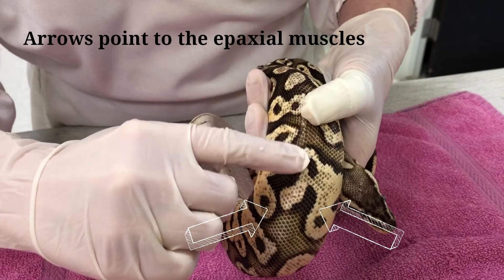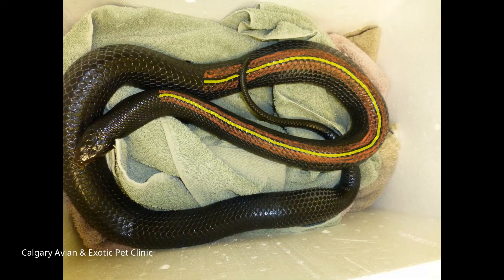Give intramuscular injections in the epaxial muscles, which are located on either side of the snake's backbone or spine. You will feel the hard spine in the middle of the snake's back. The muscles are softer tissue on either side of the spine. In this photo, the yellow line represents the spine and the orange patches on either side are where the epaxial muscles are. Again, you want to inject in the muscles located in the front half of the body.